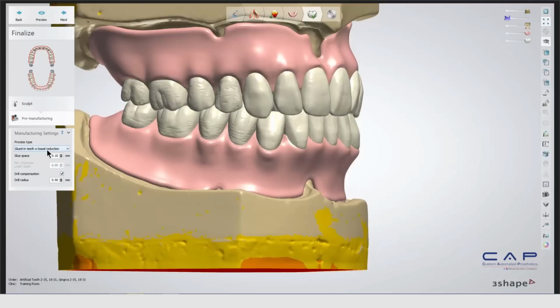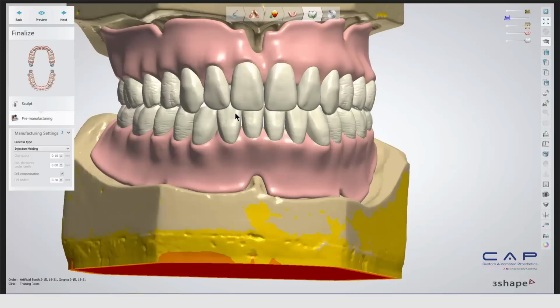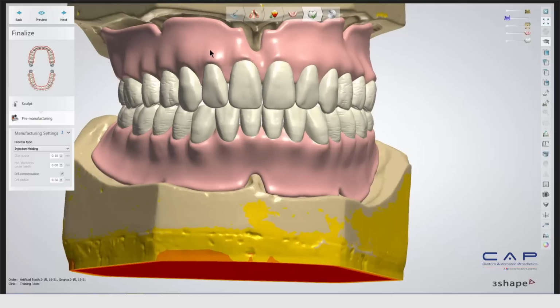So this is where we're talking about the different types of manufacturing that Bob was talking about, which is the glued-in teeth with the basal reduction, where it has you mill the top portion out, you glue in the teeth, and then it mills out the bottom portion and cuts out the denture teeth along that portion there. You can do injection molding, which is the full individual denture, which allows us to print this all as one. So the teeth are now going to be printed out of the same material at the same time as the denture, which is going to be the optimal workflow for the 3Shape process.